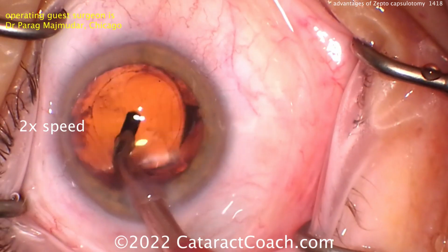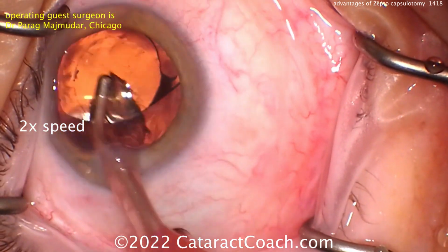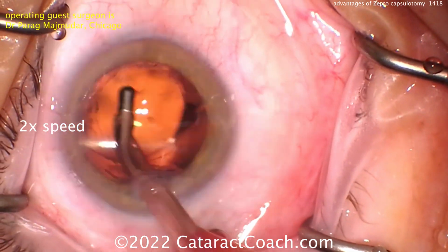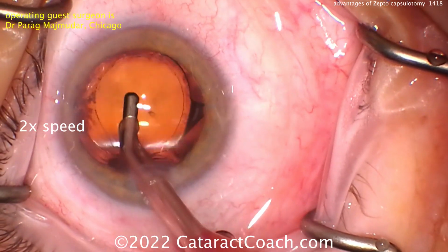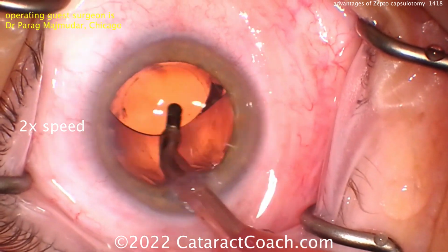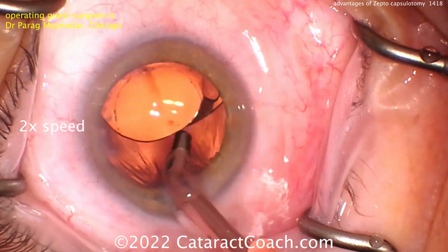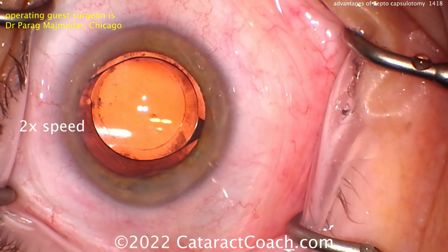And I anticipate that Centricity Vision is going to come out with options to make the rhexis different sizes as well. Now, with the capsular bag being opened up with viscoelastic and the posterior capsule held away with the optic, now that subincisional cortex was very easy to remove. Here's going behind the IOL to remove the viscoelastic, and this looks like a very clean case. And now that lens can be centered up, and we can seal up the incisions.